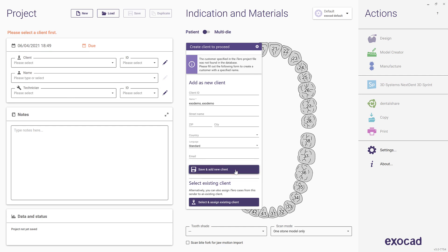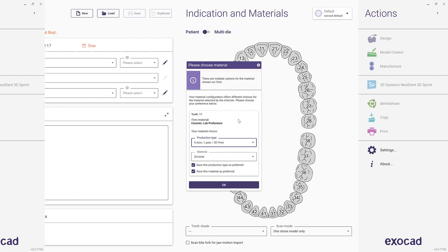Please note that the mapping is from a doctor in iTero to a client in ExoCAD, not from a practice to a client. This allows you to save individual defaults for parameters, for example Cement Gap, based on the doctor performing the treatment.